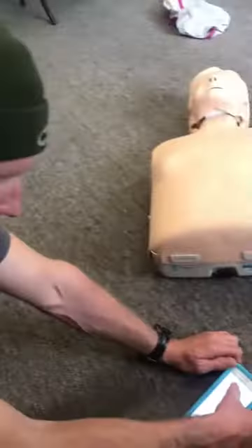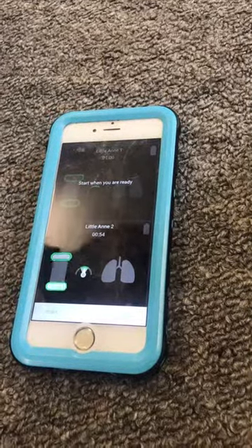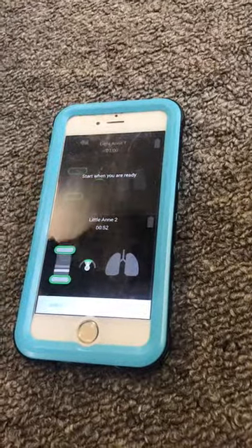Going back to the training — we can do two breaths and chest compressions as well. To do that, I push start on the right-hand side of my screen. What it's going to do is measure whether I do 30 chest compressions in between my two breaths, and it measures the breaths as well. It doesn't measure the efficiency of the breaths — it's more about whether you're doing 30 chest compressions and then two breaths — but it knows that you've done the breaths.